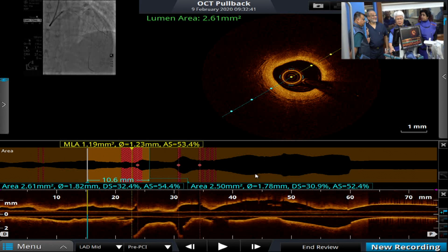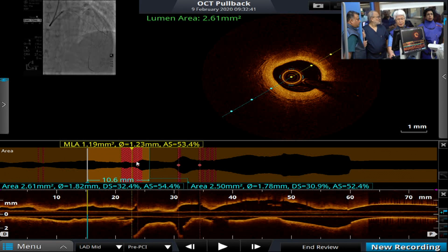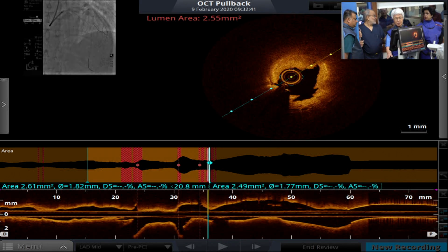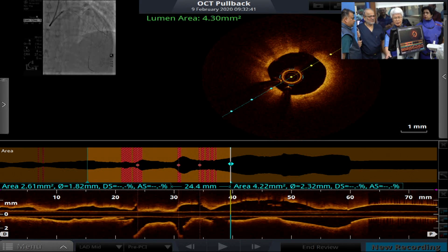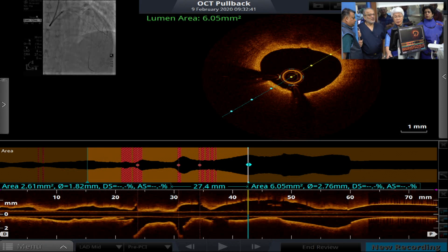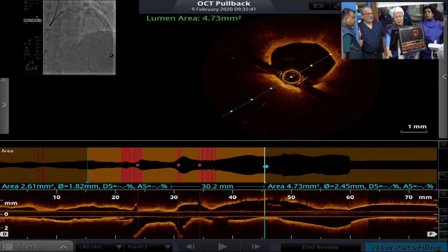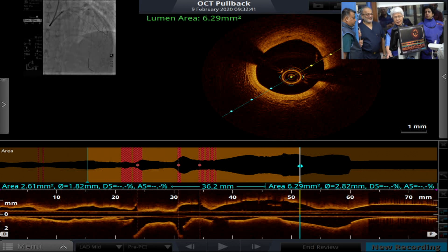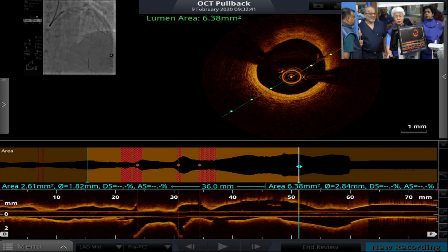Yeah, right. Okay. And then how to put the stent in the proximal? Proximal, it should be 2.75 to 3. Still there are lots of... Not 3, here, huh? Here might be the idea, but too long, right?